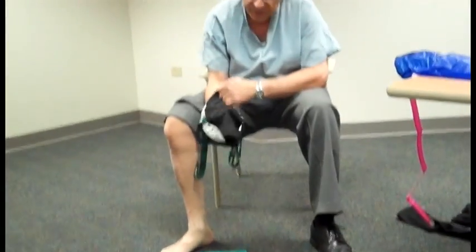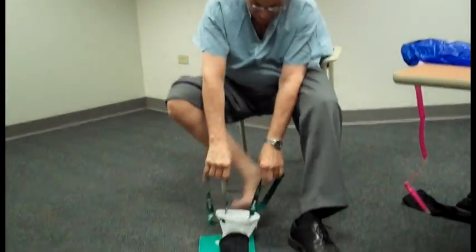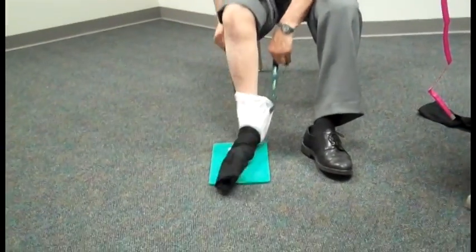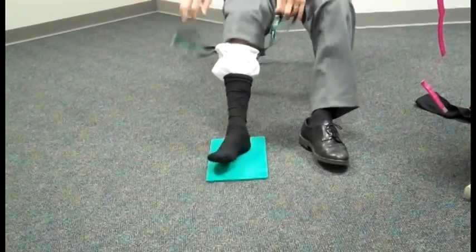The application of the stocking can be done using an assist device. Placing the device over the stocking and then pushing and pulling, one can easily put on the stocking.